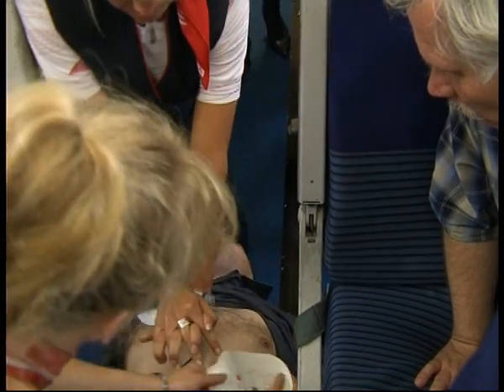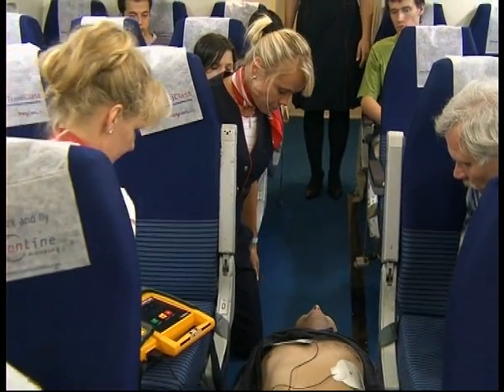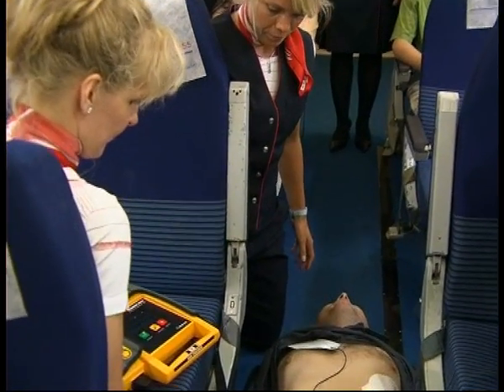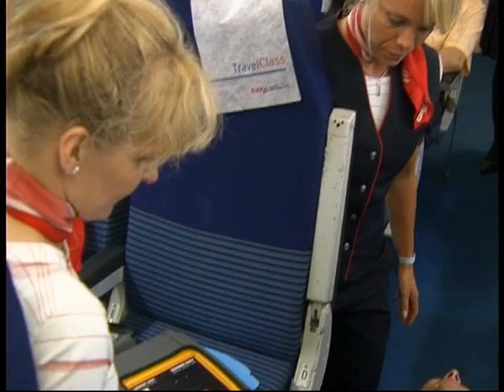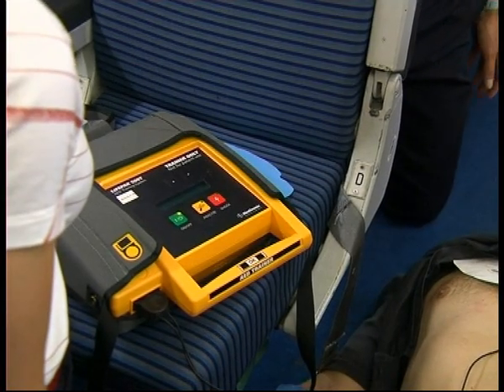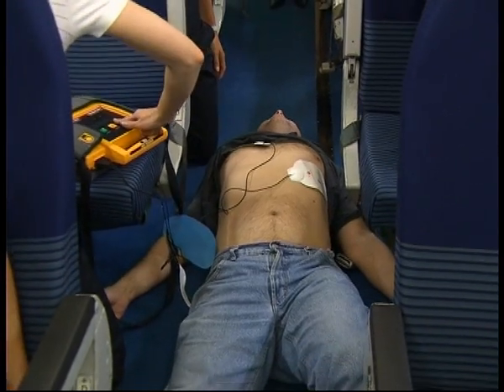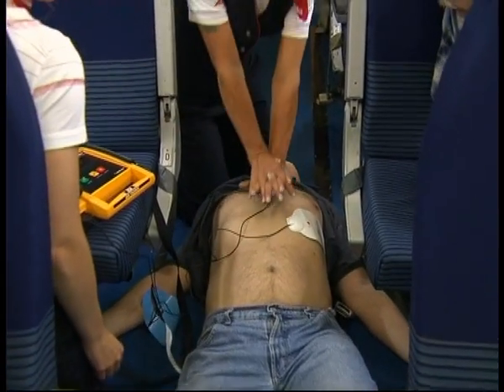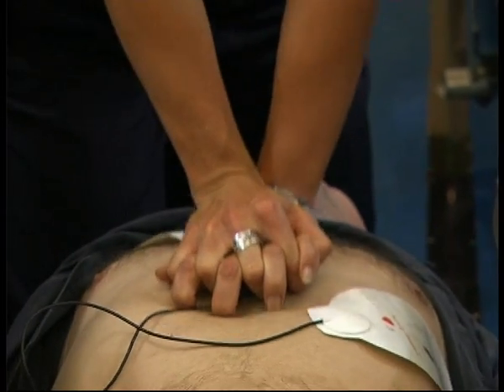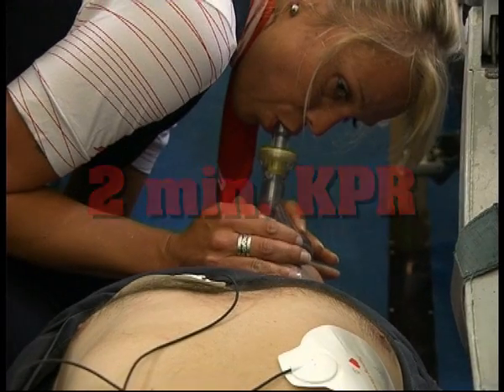Stand clear. Analyzing now. Stand clear. Shock advised. Stand clear. Push to shock. After defibrillation, we continue two minutes of resuscitation and again let the device analyze the heart rhythm.